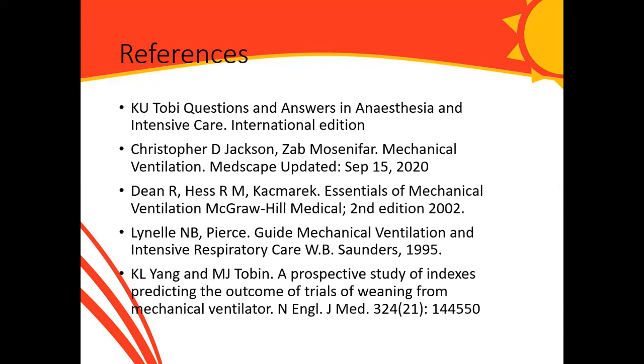But if you are putting the patient on a T-piece, how will you get the tidal volume? Sometimes the best thing is to actually do it with the patient on the ventilator, especially a patient on pressure support.